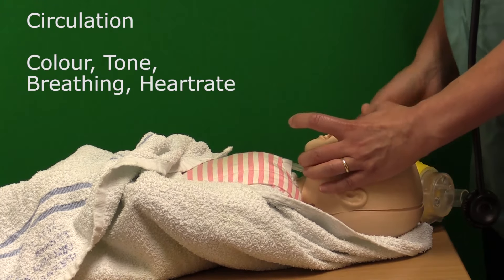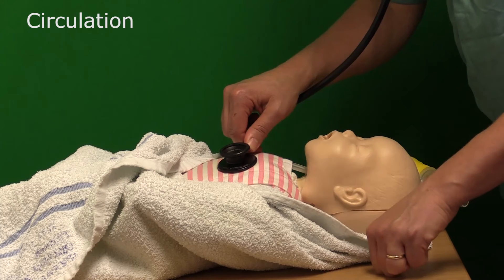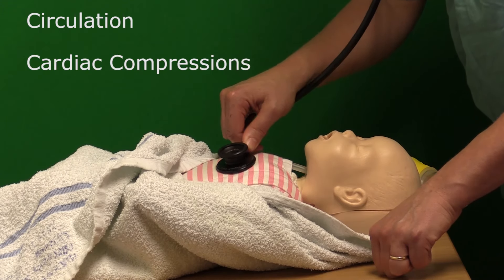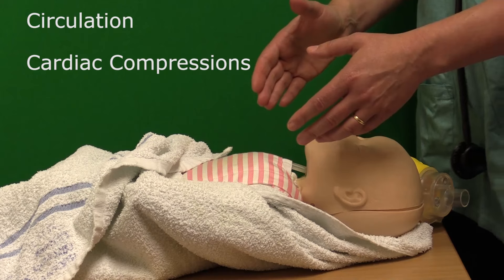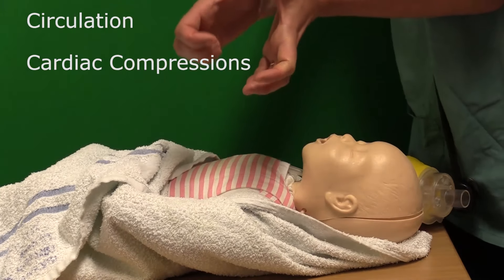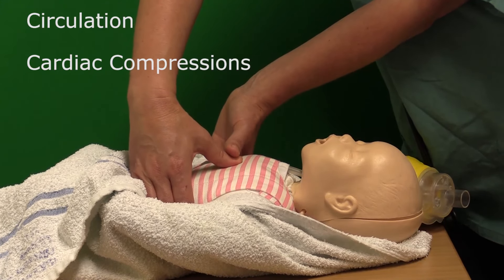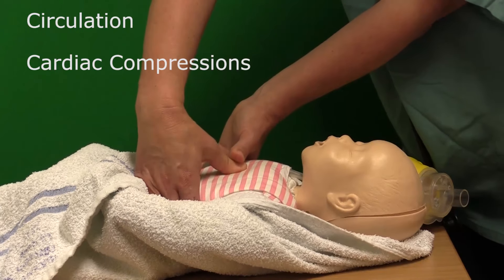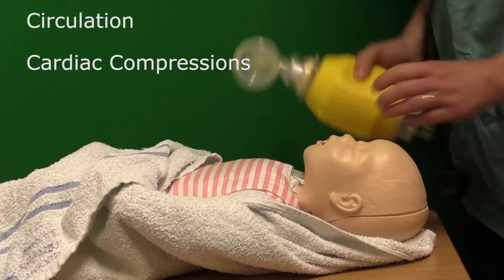Reassess: colour, tone, breathing, and heart rate — once again listening to the baby's heart rate and tapping it out. If the heart rate still remains slow at this point, then you go on to give cardiac compressions. Cardiac compressions can be done in two different ways. Best practice is the encircling technique, where the person supporting you encircles the baby's chest and places the thumbs on top of each other on the inter-nipple line — just a little bit lower than the nipples — on the sternum centrally. The baby's chest is then depressed by a third and released, and this happens three times to every one ventilation breath.